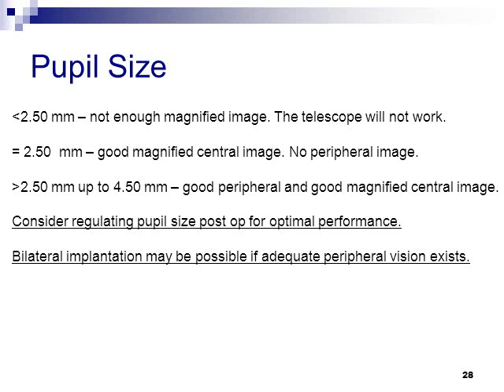Pupil size is an important factor in the way that a patient can see the world following implantation. If the pupil is too small, below 2.5 millimeters, there is a problem because of the reduction in the amount of light that reaches the first mirror, and there is also no peripheral vision at all. If the pupil is 2.5 millimeters, the patient sees the central vision very well and with good contrast, but still there is no peripheral vision.